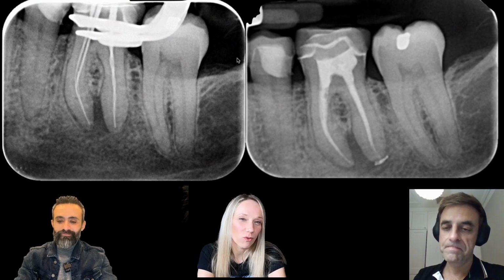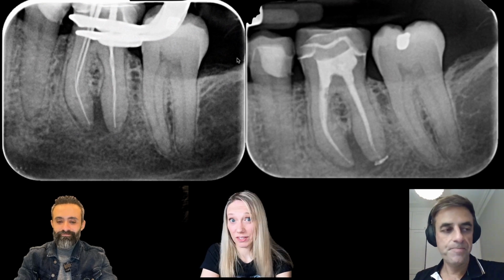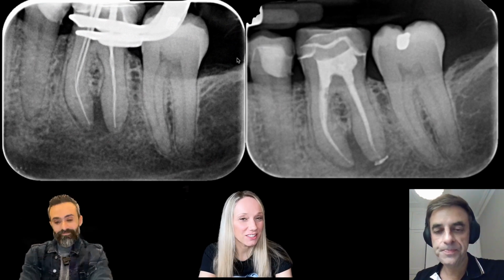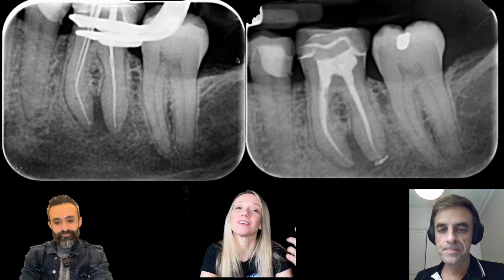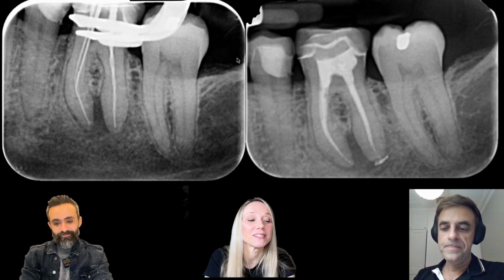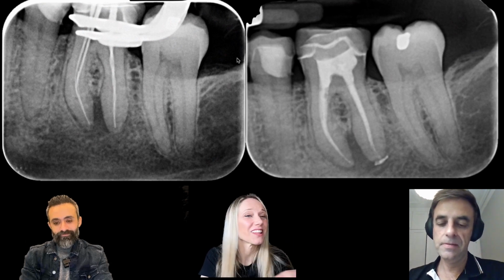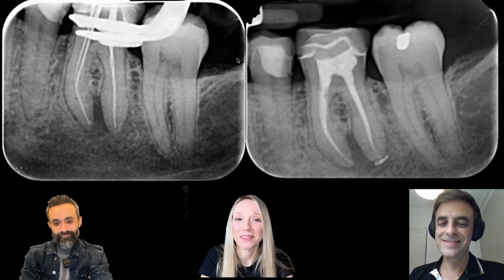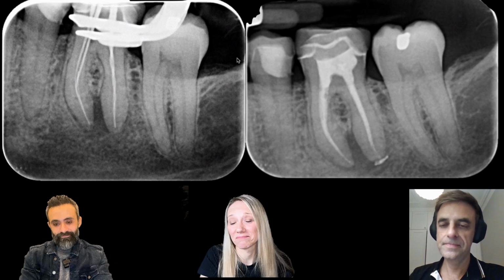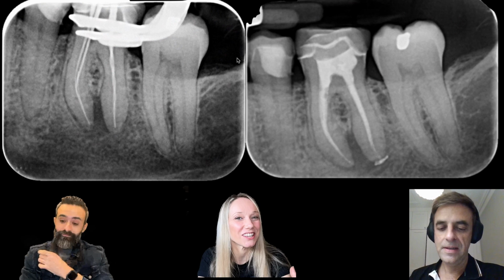I have one question for you now. So you have a lot of experience. You are a skilled clinician. You do a lot of endos every day, but still you're saying that even if you're extremely experienced, you still need a CBCT in your daily practice, besides having performed hundreds or thousands of treatments without those scans, because CBCT is kind of new as a tool for clinicians.